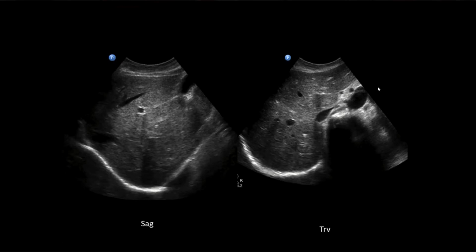Maybe our medical students can chat, you can talk. Don't make me feel like I'm alone. Homogeneous, anyone? Yes, hopefully. Okay. Sure. We'll go with homogeneous. All right, sounds really good.